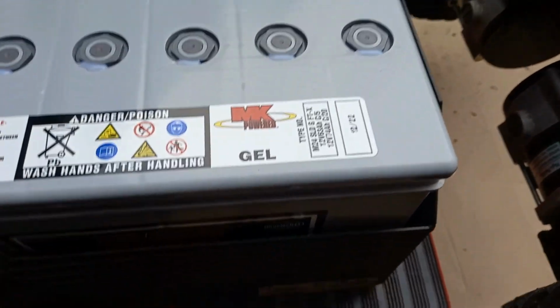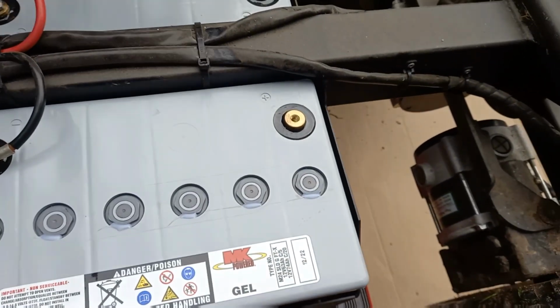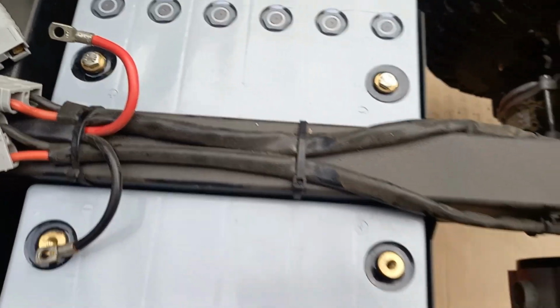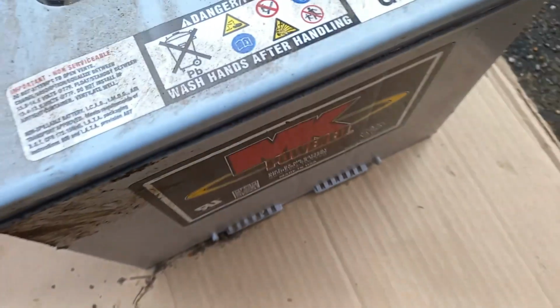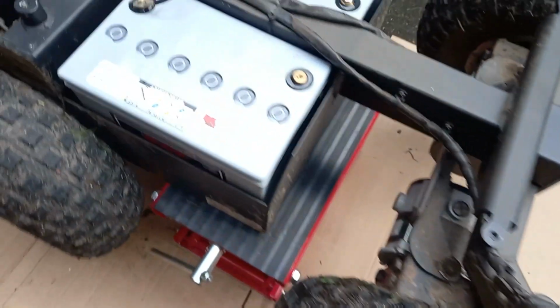I think it's because they're quite tight, and it's got these cable ties here on the wiring. And at the bottom of the battery, if you look at the bottom, there's a lip. There's a lug on the sides, you see. So it makes them very tight. Really, really tight. But they're in.